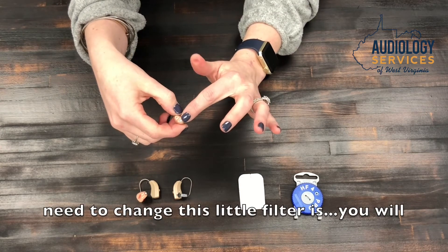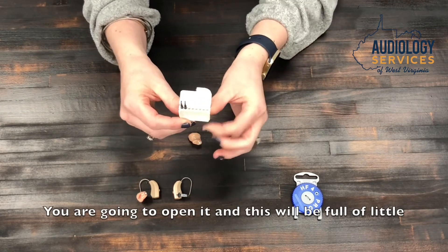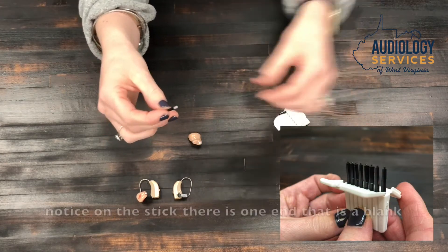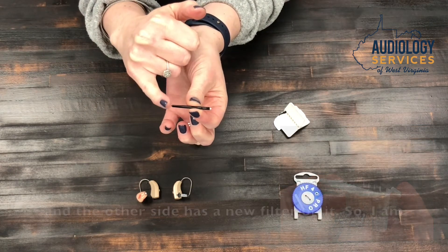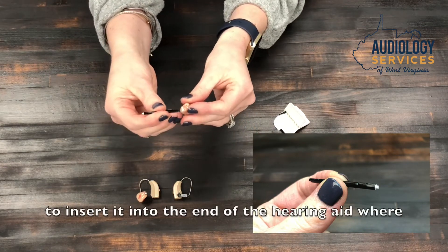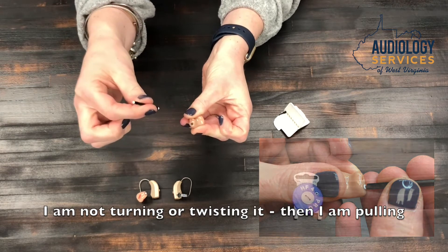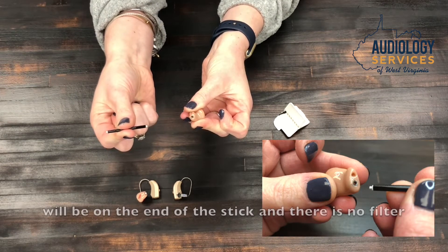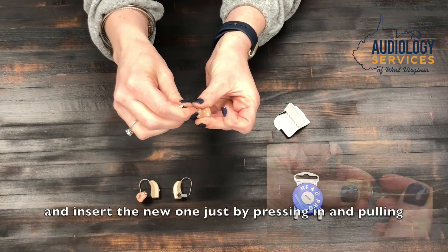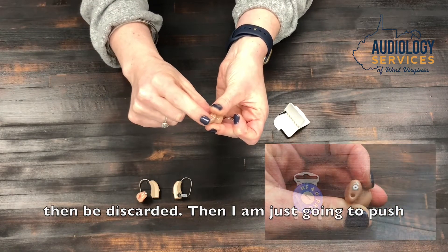To change the filter, grab the case that comes with your hearing aids. Open it — it will be full of little sticks, and that is how you change the filter. Each stick has one blank end and one end with a new filter. Take the blank end, insert it into the end of the hearing aid where the filter sits, press it in — don't turn or twist — then pull out and the old filter comes out on the stick. Turn the stick over, press the new filter in, and pull out. It will stay in the hearing aid. Discard the stick and press down to make sure it's secure.